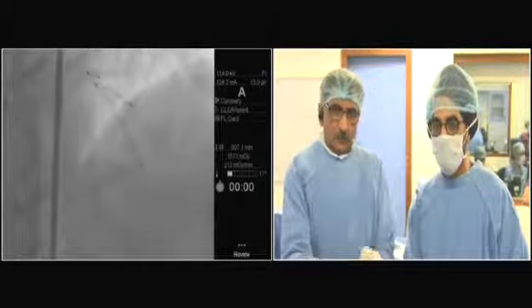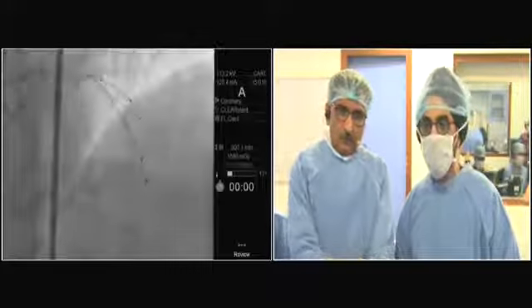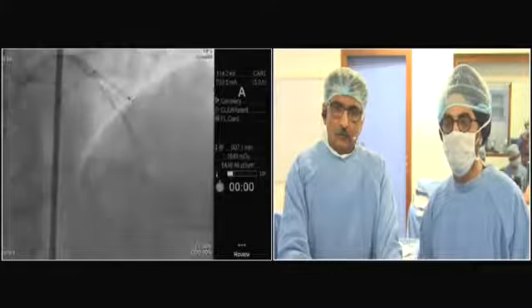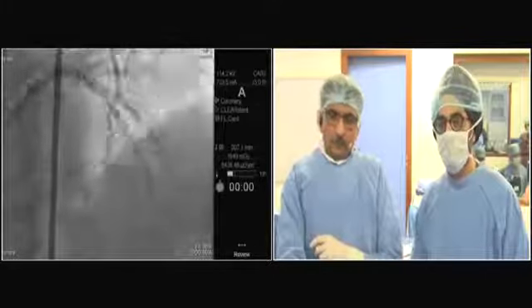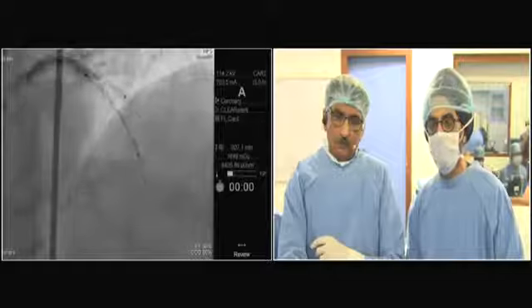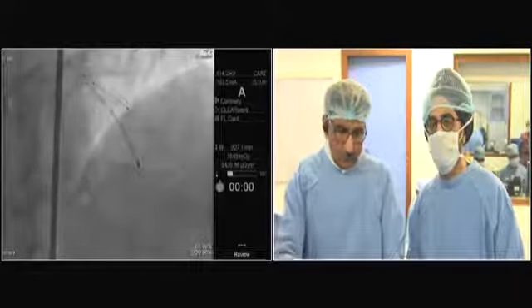Any comments about the decision to do a 2-stent technique up front? It is certainly a case for double stenting, so we know that from the beginning. So the discussion is the way to perform it. I think we can do it using the provisional, and we can do what Xiaoliang will probably say, that we can do easily, probably with DK crush. So both techniques, you don't have to think that provisional is only for simple.